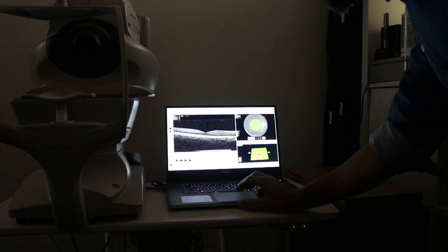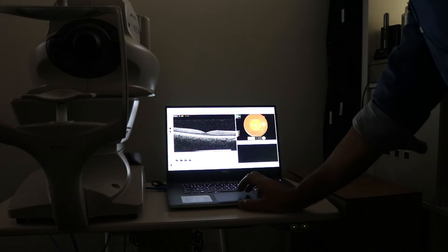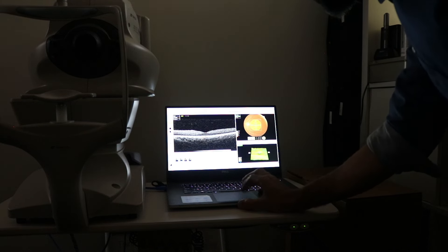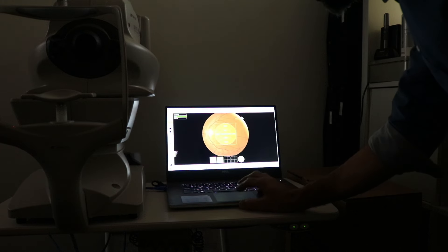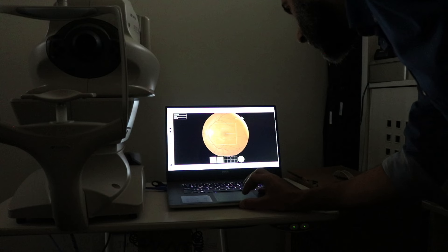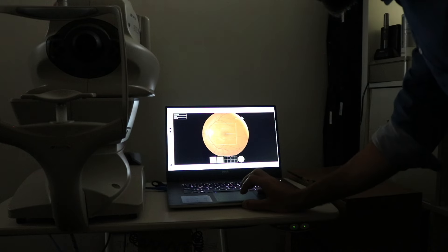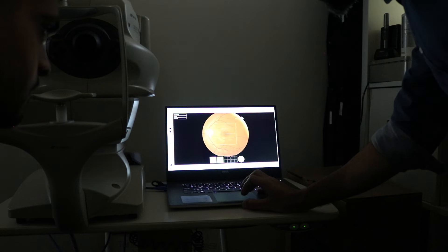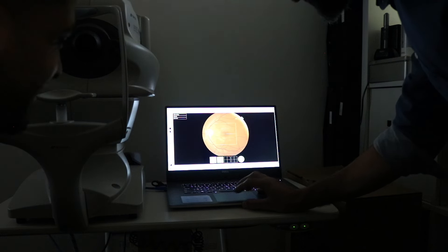So if we now compare that to the other eye, let's go to the left eye now. And can you see anything on there that you would think would indicate a little blood spot on your retina? That's what I'll ask you.